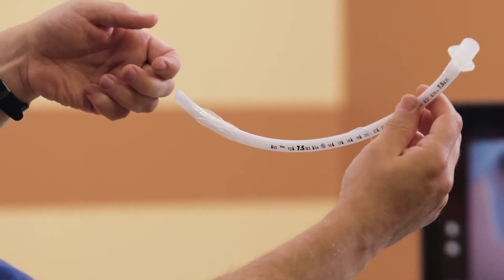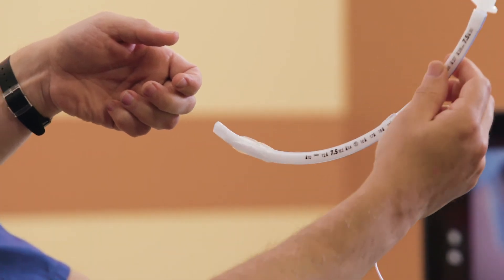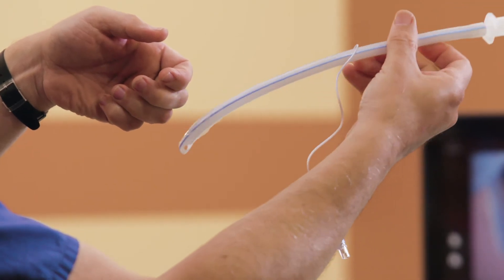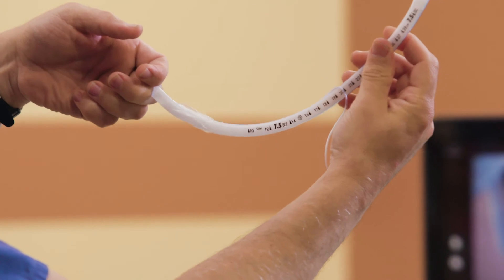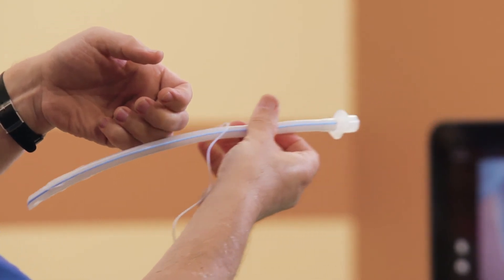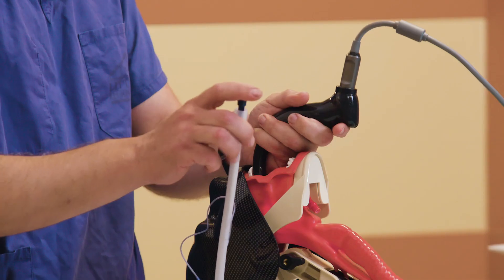Let me show you this from a different perspective. The inclination of the trachea is pointing down. The tracheal tube curvature is pointing upward. By rotating the tube to the right, we are changing the inclination of the tracheal tube, and we are also disengaging the tip of the tube, which can catch on the cricoid or tracheal rings. And now the bevel goes up and it has less mechanical resistance to insert into the trachea.